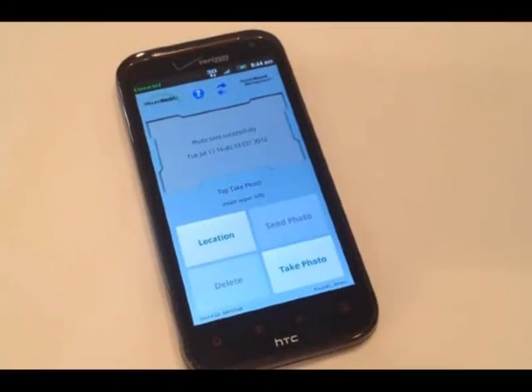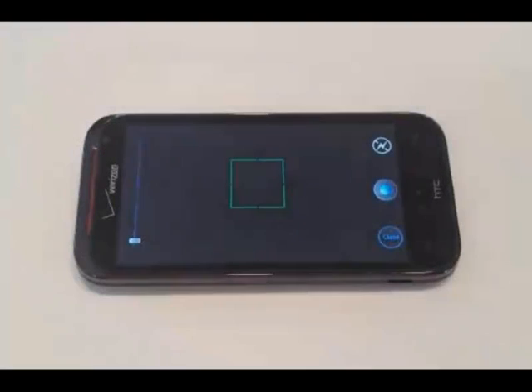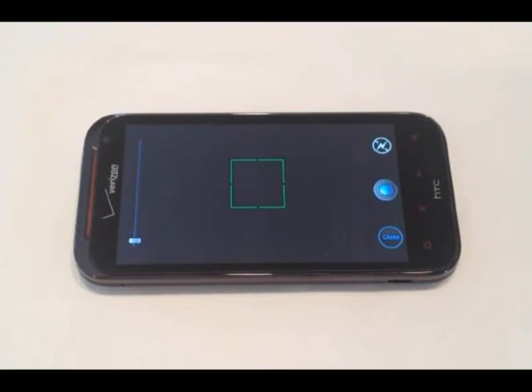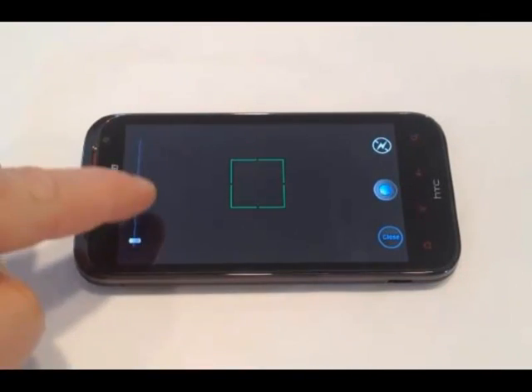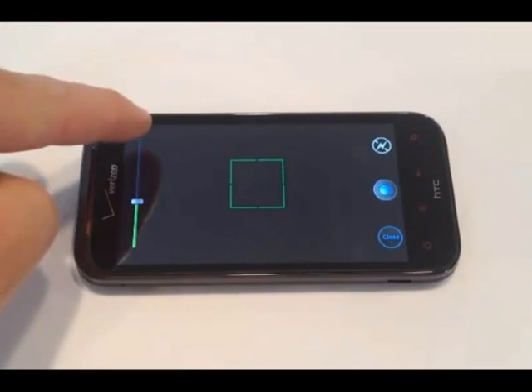To start, tap the Take Photo box. On the right side of the screen, you will see a button that allows you to turn the flash on or off, the camera button, and a close button to exit the screen. On the left will be a slide bar to zoom in and out.